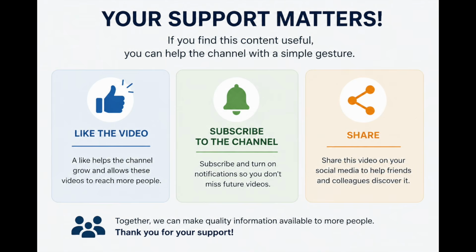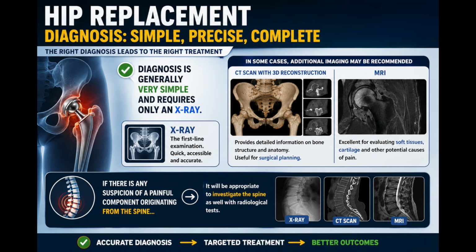Diagnosis is generally very simple and requires only an X-ray. In some cases, a CT scan with 3D reconstruction or an MRI is also recommended. Obviously, as I mentioned earlier, if there is any suspicion of a painful component originating from the spine, it will be appropriate to investigate this level as well with radiological tests. The X-rays remain an indispensable test and provide significant information both for diagnosis and for preoperative planning of surgery.